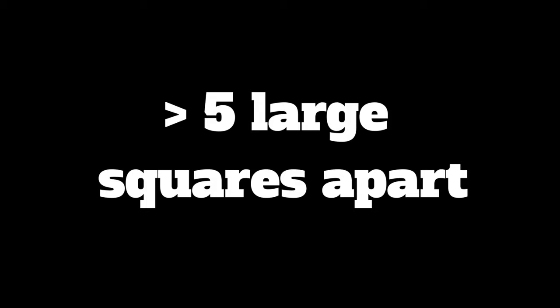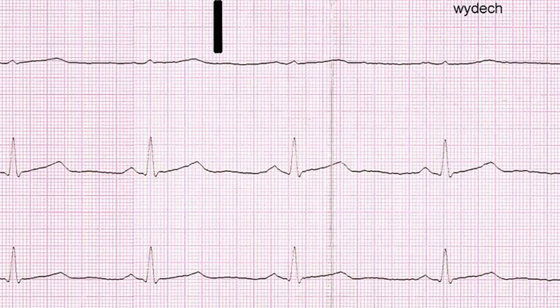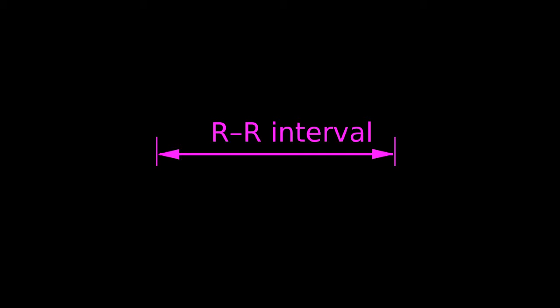Right. Now, rarely you will get a very fit young athlete with a slow, efficient heart, like this one. He is healthy. Let Dr. Sutton make the diagnosis. Oh, thanks for your help, Neil.